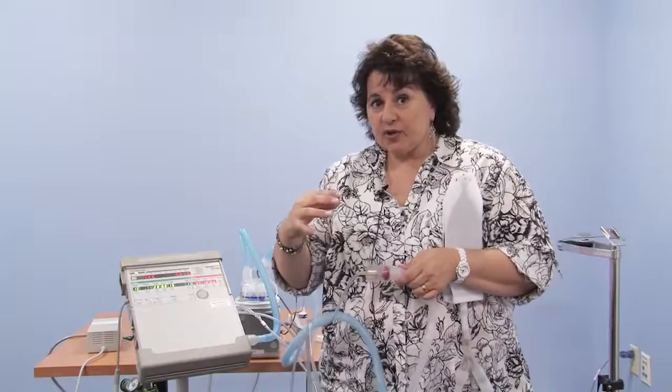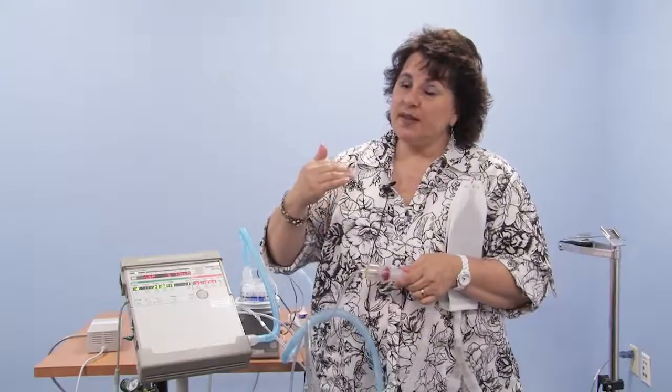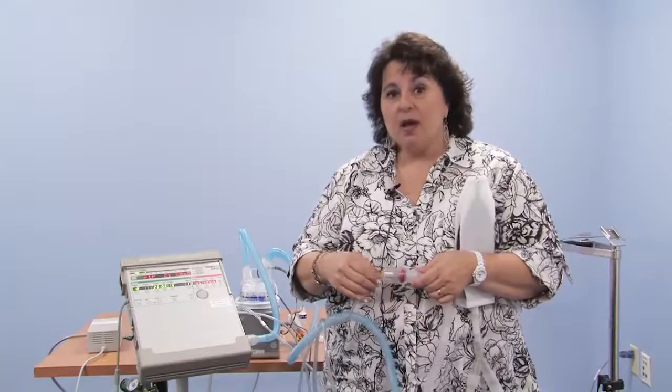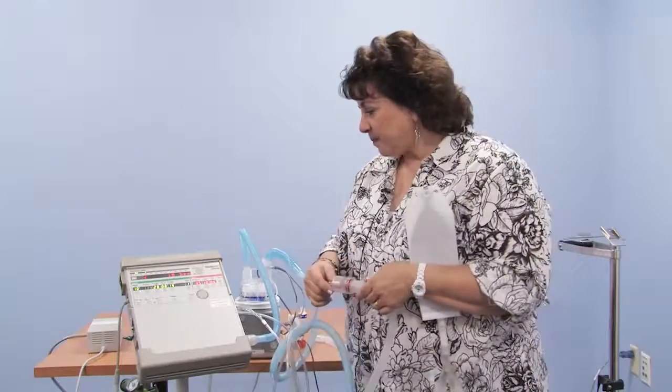And the positive end exhale pressure is to help keep the lung air units open between the breath cycles. If your child's having difficulty with breathing, with fluid in the lungs, with oxygen problems, that PEEP might go up 6, 7, 8. And typically it'll never be below 4. 4, 5, 6 are average numbers. If a child's on 7 of PEEP, someone might question where that came from, why. Maybe they had a little fluid in their belly and it was kind of hard for the ventilator to help them out. But these are all things that you should have learned while you're caring for them in the hospital. And you will be reinforced with these numbers as you learn the ventilator and then see it on your child and get to know what they're all about.